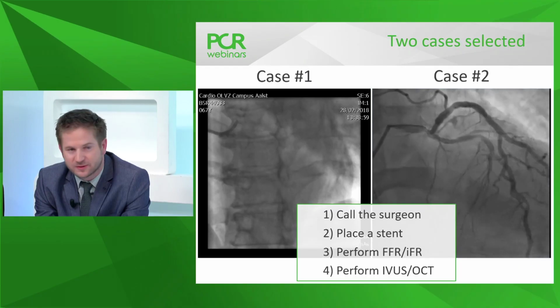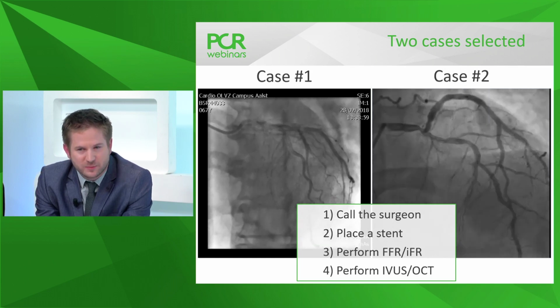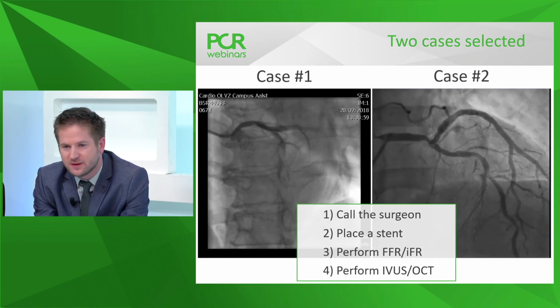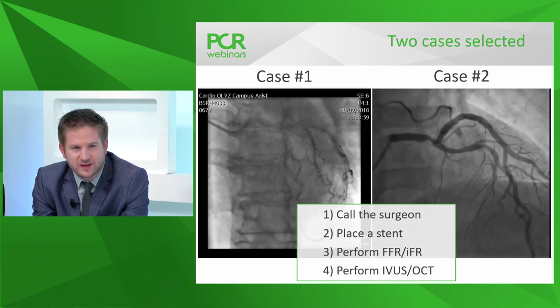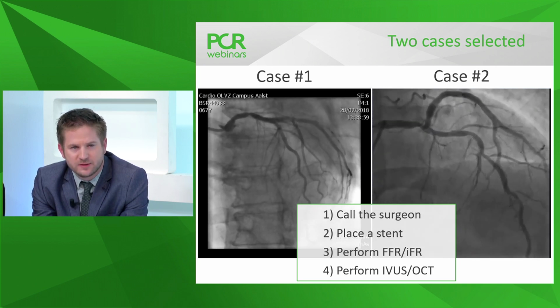Thank you very much. Is there anything we didn't discuss so far, Gabor, that you would like to integrate? Well, I completely agree with Alaide that these are ambiguous left main expressing very well the uncertainty of any decision based just on the angiogram. And especially for the second case, which is even more complex because we have left main, we have sequential lesions in the LAD. We need definitely further, more precise evaluation of the disease, and I would definitely go for functional evaluation in these cases.